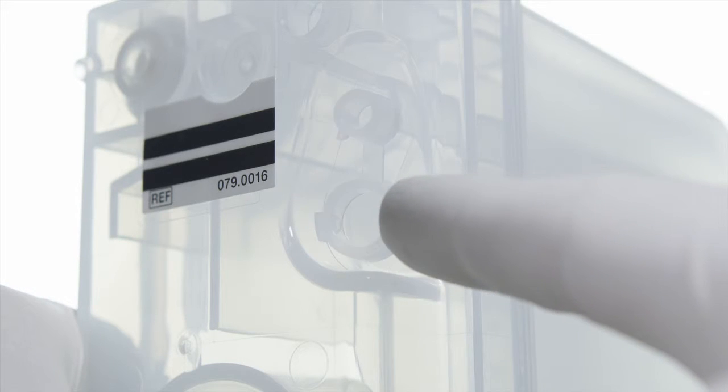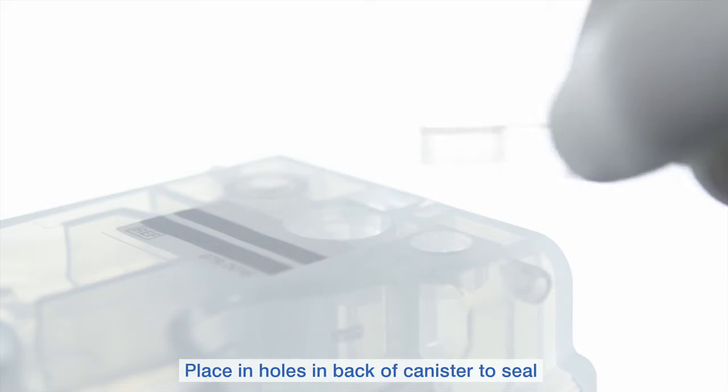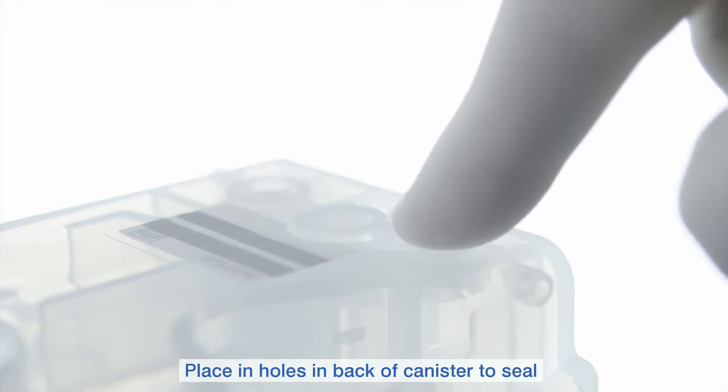You will then need to remove the plastic seals from the side of the canister and place them in the holes on the rear of the canister to seal.